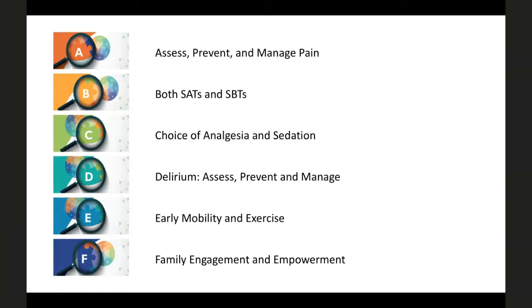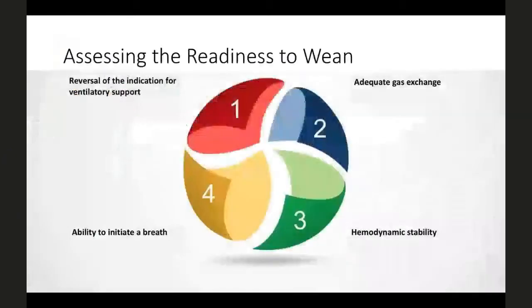As I said before, we need to focus on the patient and his problems rather than focusing much on the sophistications of mechanical ventilation. The mechanical ventilation sophistication, modes, alarms, everything is for your help in assisting the patient recovering from his pathology. How do you assess the readiness to wean?